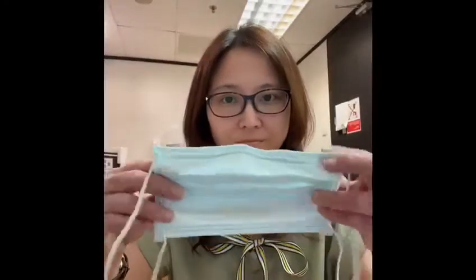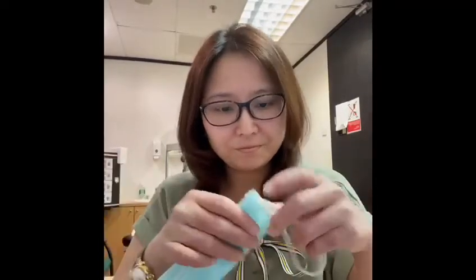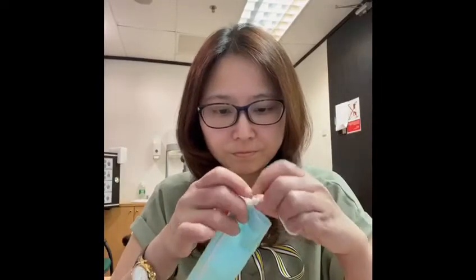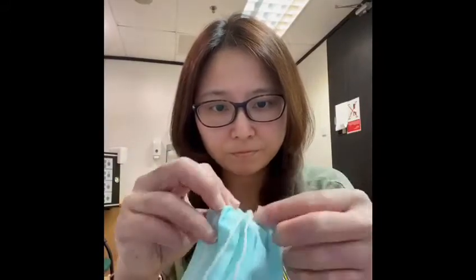This is to show how to use a knot and tuck surgical mask. First, tie a knot on each end of the surgical mask. Try to tie it as close to the edge of the mask as possible. Next, tuck in the side of the pleats to minimize gaps in between.